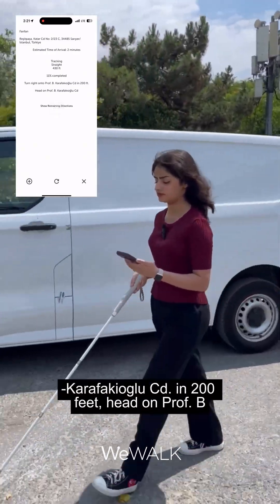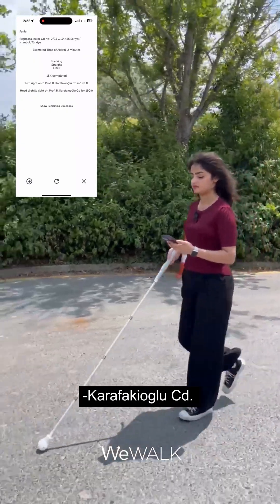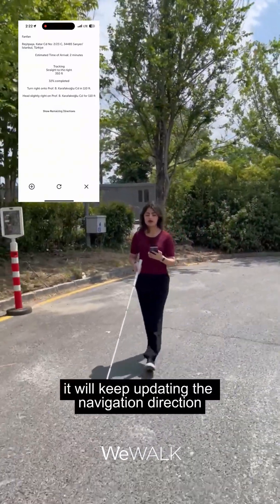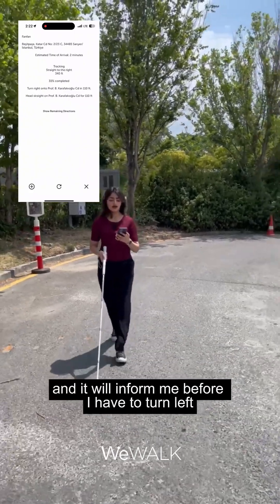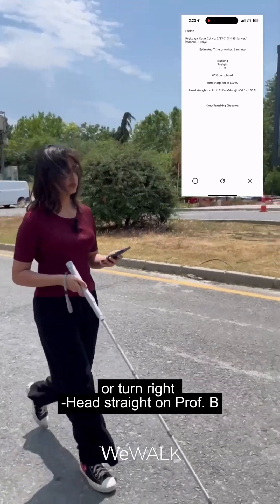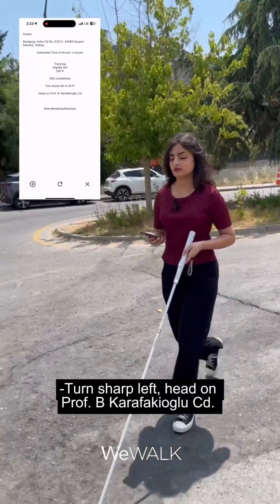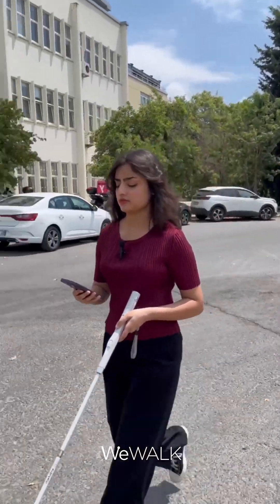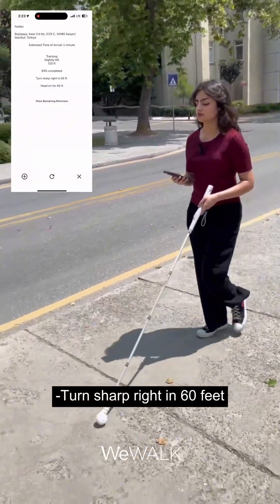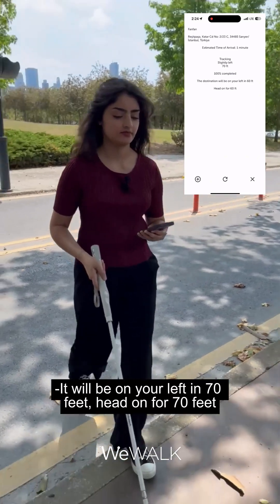As I'm moving, it will keep updating the navigation directions and inform me before I have to turn left or right. For example: 'Head straight on Professor B Karavakiolu CD for 120 feet,' 'Turn sharp left,' 'Turn sharp right in 60 feet,' and 'Destination will be on your left in 70 feet — head on for 70 feet.'